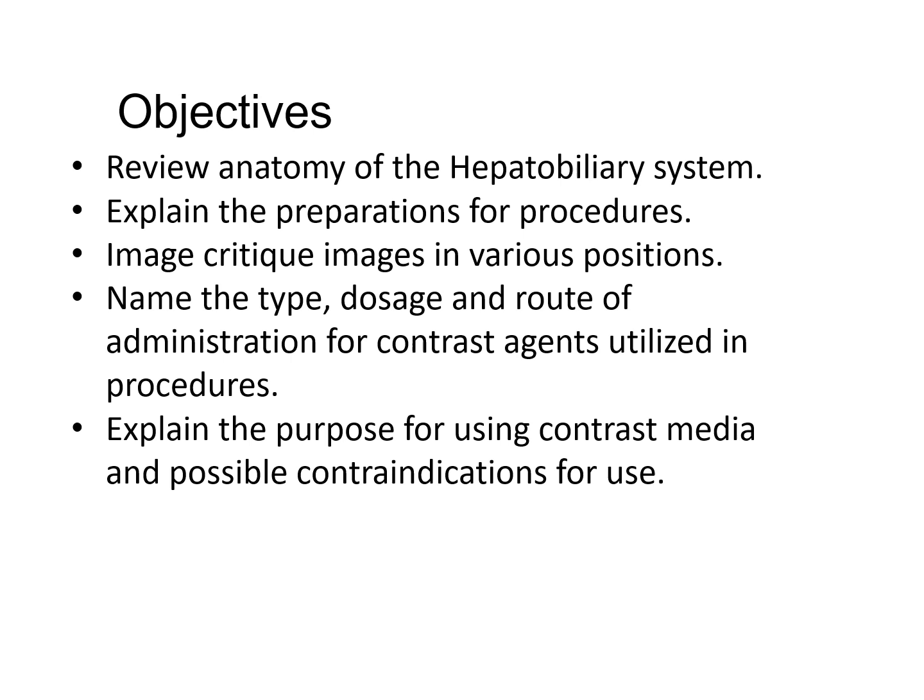Explain the purpose for using contrast media and possible contraindications for use. I can't think of any contraindications unless they were known to be obstructed, and then you're just going to make them miserable by adding pressure to the biliary system. Even in the case of a peritoneal leak, the iodine contrast is reabsorbed in the peritoneal fluid and drained through the lymphatic system.